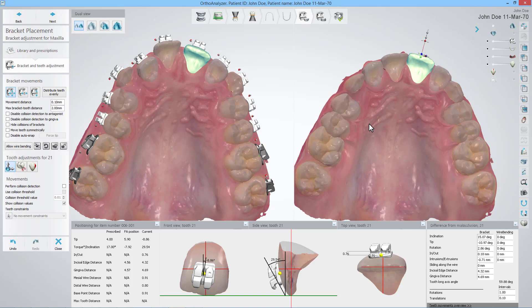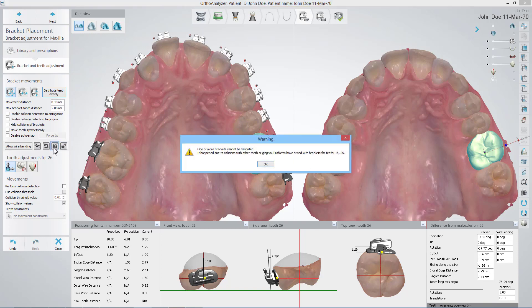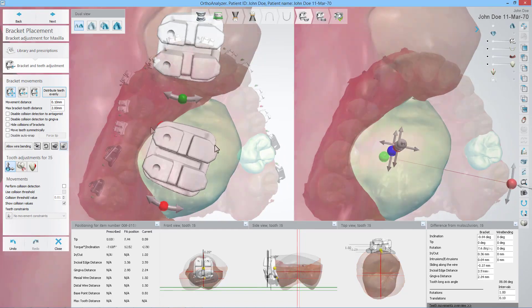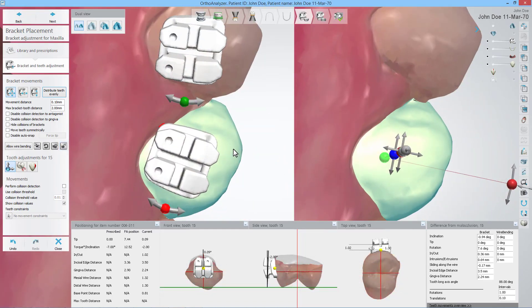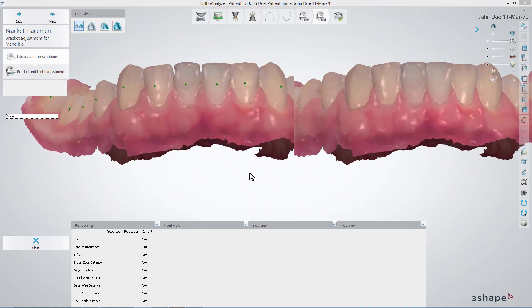Here you can use the Distribute Teeth Evenly function if needed — it will distribute them evenly across the arch. To finish this step, you must lock the bracket positions by clicking the Validate All Brackets button. Once you do this, you will be warned of existing collisions between brackets and antagonists, as well as between brackets and gingiva. Should such collisions occur, you must take action before the software allows you to proceed, so there is no risk of overlooking them. When all bracket positions are validated, click Next to continue. Repeat the bracket placement and adjustments for the antagonist if needed.